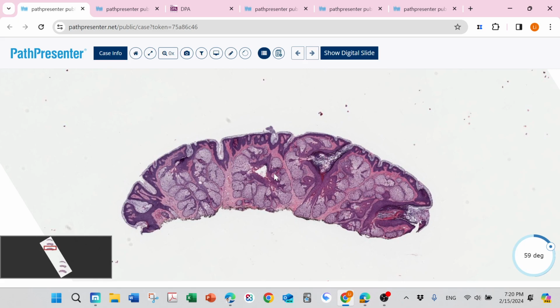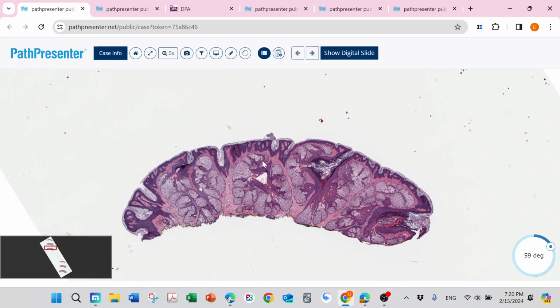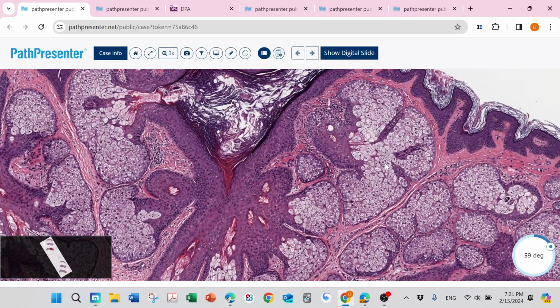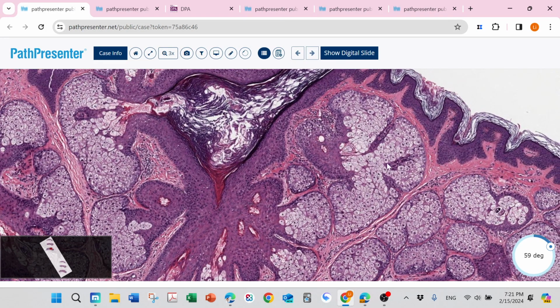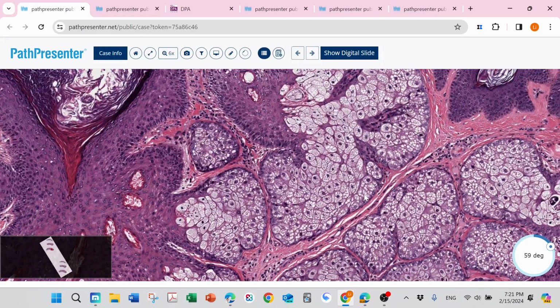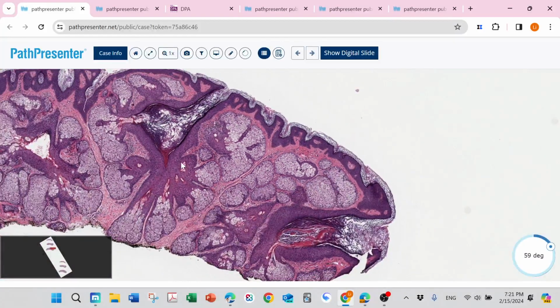How could we tell them apart? First, for sebaceous hyperplasia, the sebaceous gland is just hugging a hair follicle. And then at high power, we can see most of these structures are just sebaceous cells. In the periphery, we do not see germinative stem cells. Usually in sebaceous hyperplasia, there is just a single layer of these hyperchromatic basaloid cells. If we have several multiple layers, that is at least sebaceous adenoma. So this one is just sebaceous hyperplasia.